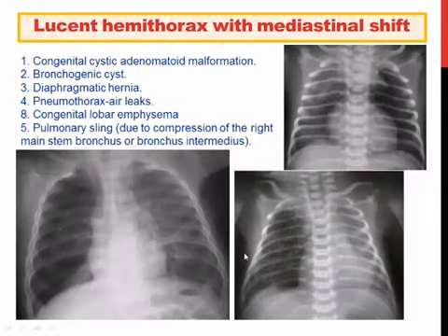Know the differences of air leaks between adults and children. Despite the typical appearances known in adults, consider the sharp heart sign or a crescent-like lucency by the heart in patients that are X-rayed supine.